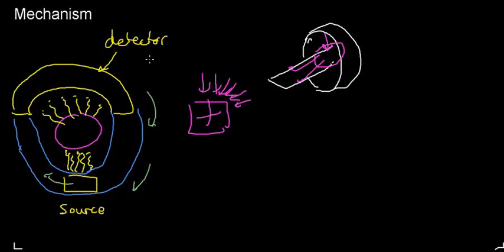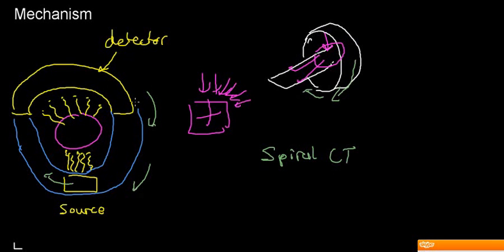There are a lot of interesting exotic CT machines like the spiral CT. And all the spiral CT really is, is the principle of having this thing turn, just like we discussed. You're going to have this tube turn, and alongside this tube turning, you're also going to have this little surface pushed forward as well. And what that creates is it minimizes the time of the imaging, the time that it takes to create the image.